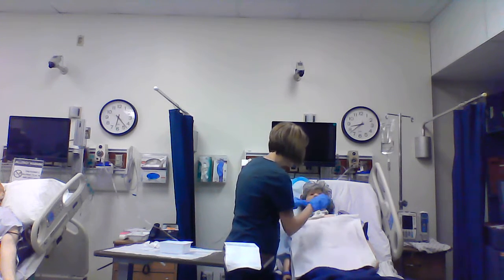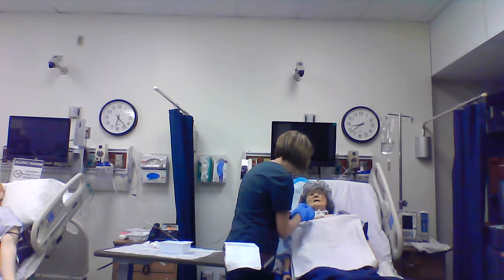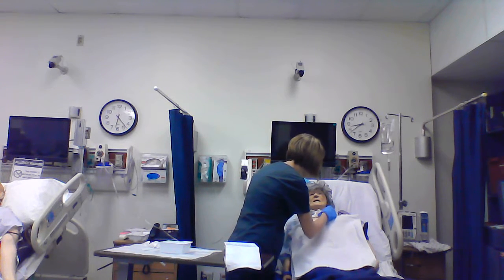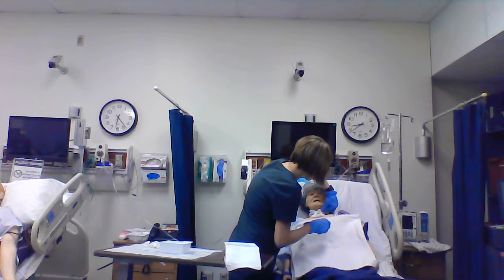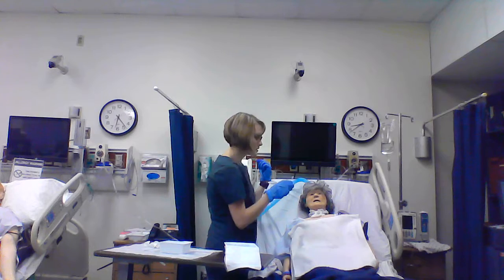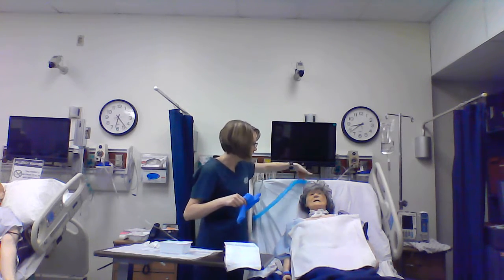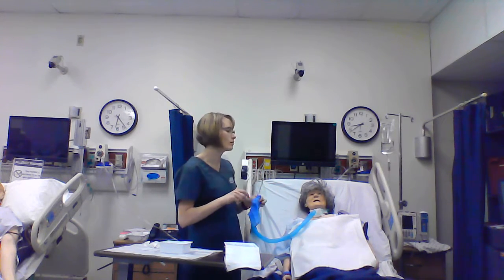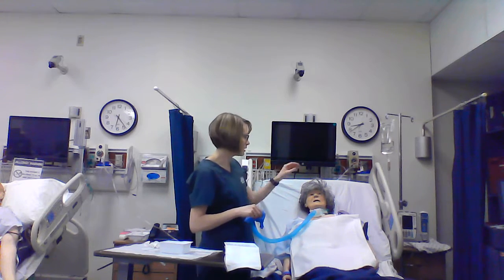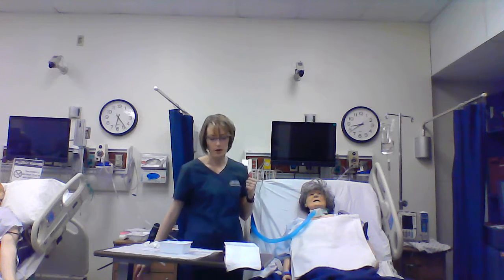Here. So I have them up above the trach ties. I'm going to go ahead and contaminate one hand just a bit just to pull this through. Here. And then keep this sterile, press this up, and then again with the contaminated hand, pull this up. So she has a new V-sponge. At this point in time, I would doff sterile gloves. I'm going to reapply her oxygen. If at any point during that procedure she needs oxygen because she's desatting or she's in distress, I would doff sterile gloves, apply her oxygen, and put on a new pair of sterile gloves and continue when she was ready.